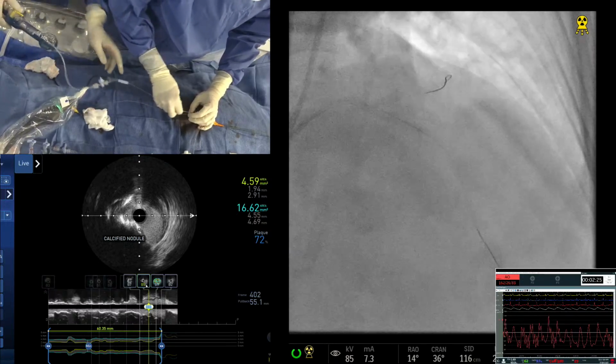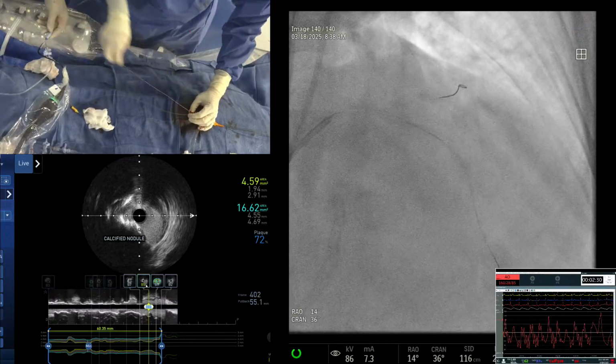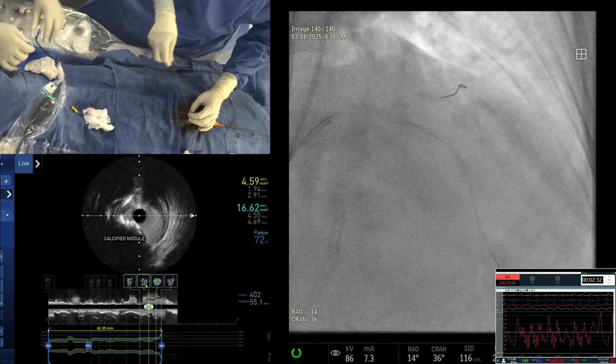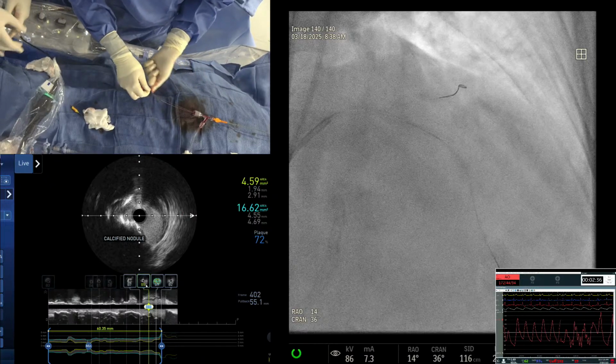Yeah, exactly. That's what I meant. In the DISRUPT CAD 3, constantly, you need 54. Good. Get a balloon. That's the one we have. Yeah, we are 3-0 right now. And that is okay.